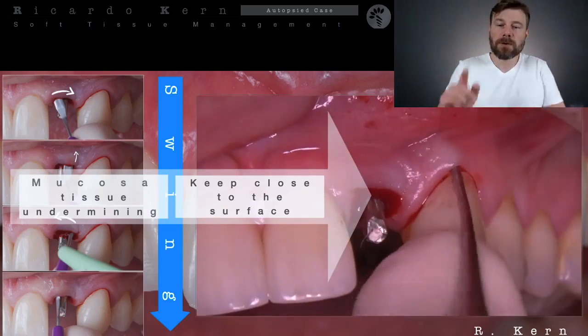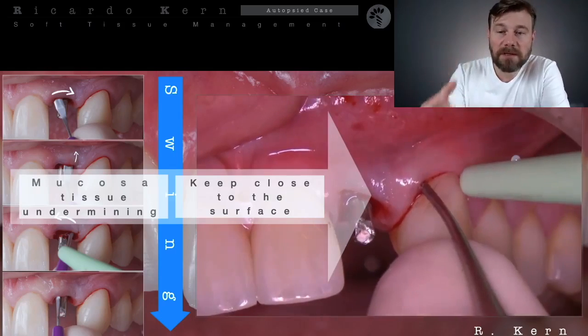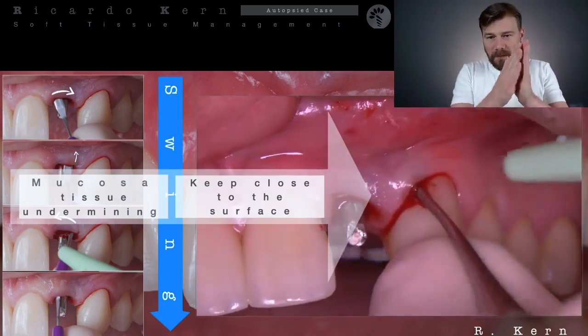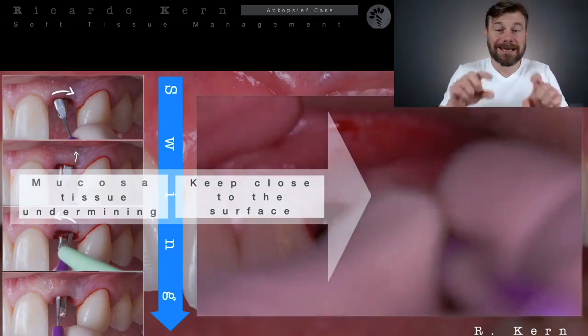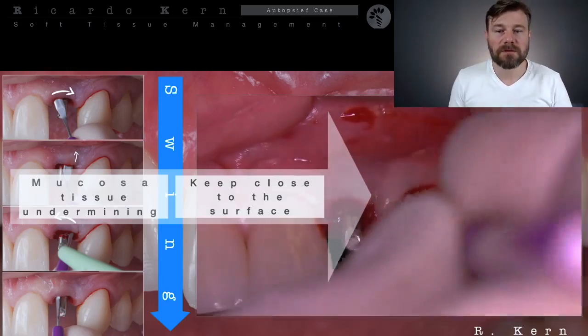Okay, so in this case, as you are seeing here, we are splitting, also preparing, tunneling the canine, because my graft is going to fill from the mesial part of this lateral until the distal margin of this canine to be tucked under this papilla, exactly the papilla where I need a little bit of volume.